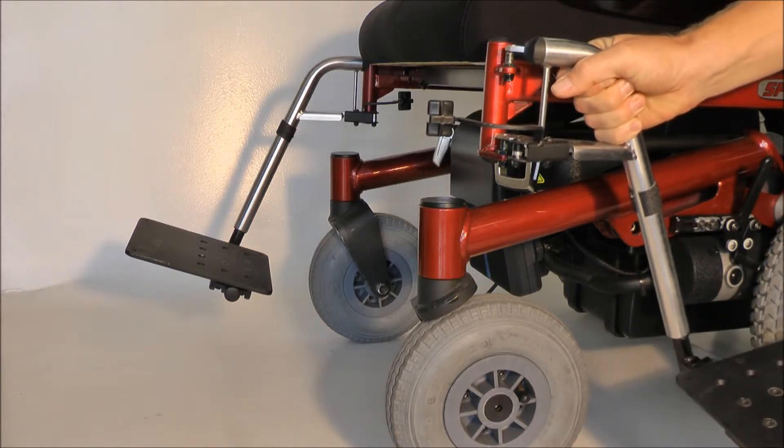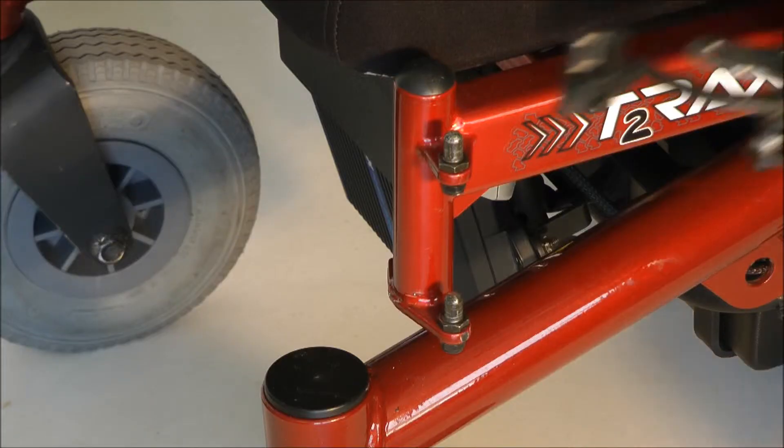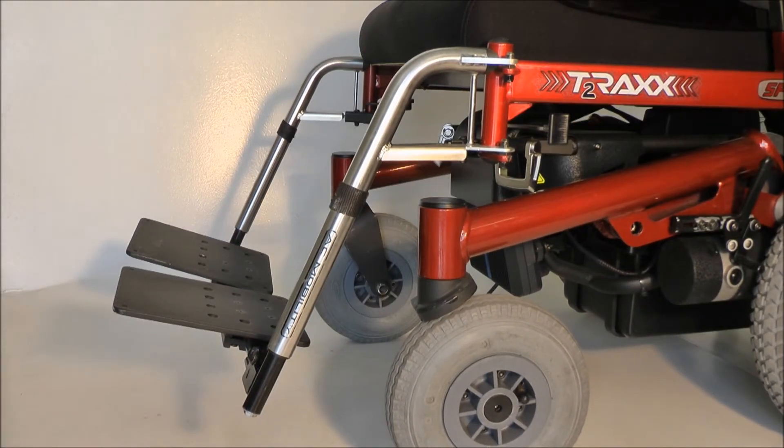To put it back, make sure you line up the holes for the leg hanger with the seat rail, and just push it back in and it clicks in position by itself.